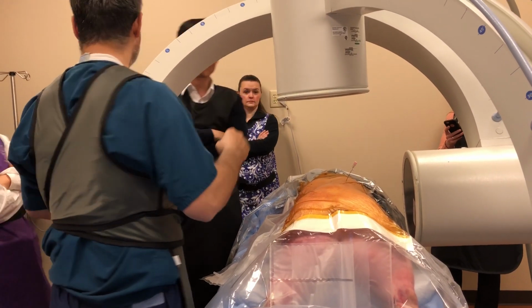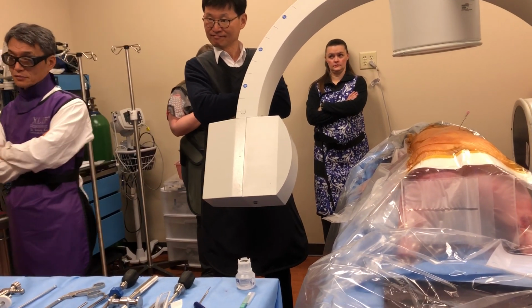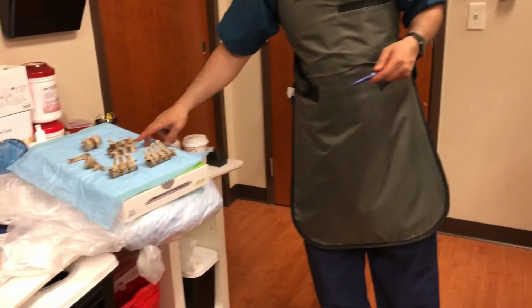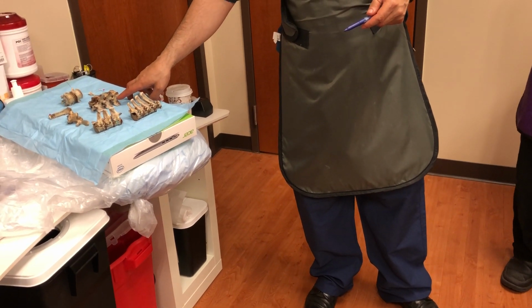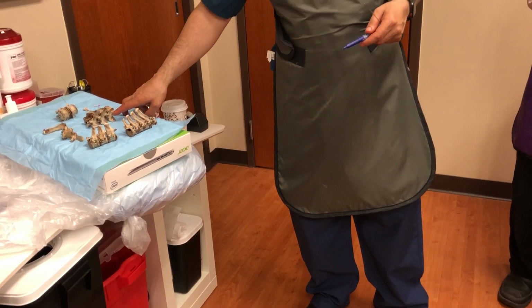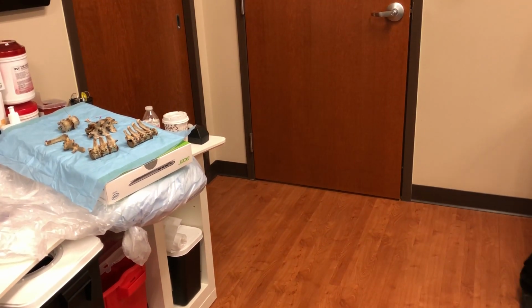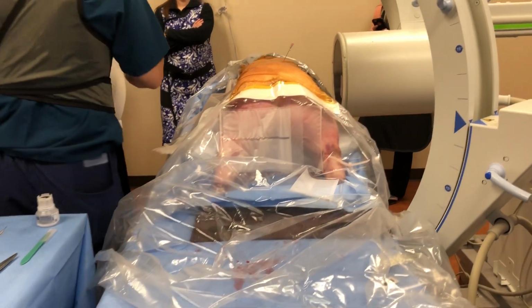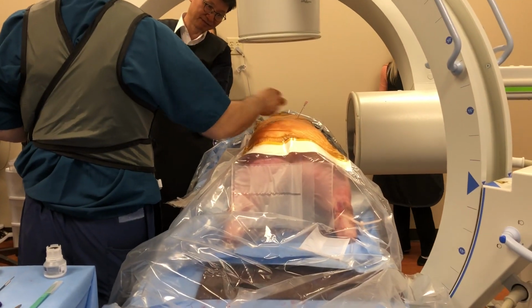Here on the pig, we are not anterior to the transverse process. Because as we described in the pig, the transverse process is here on the bottom of the pedicles. But in humans, the transverse process is below, and then you are actually anterior to the transverse process. And for that reason, in the United States, you can code it as the anterior approach. You don't have to worry about osteophyte because you're going anterior. But you're absolutely right, in the far lateral approach, you're going to get into the facet.